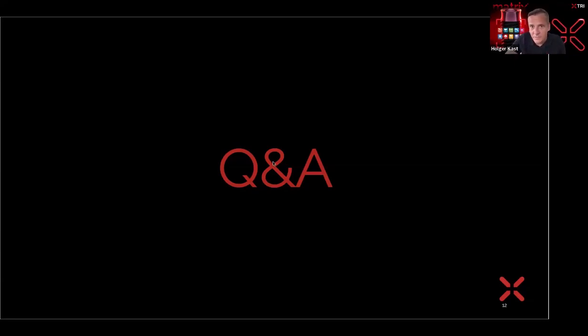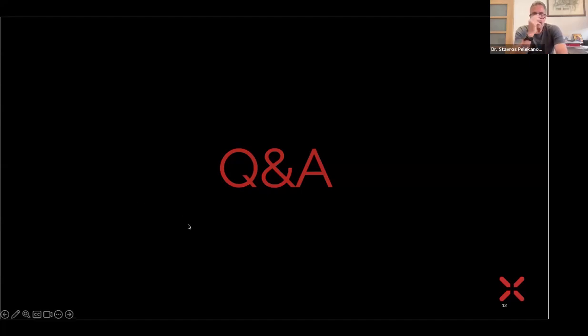I know you're really short on time. That's why the last question: the flex fit of the FP1, is the wax up printed? That's a good question, since I saw it was ready before surgery started. Maybe you can explain how we did that. The flex fit of the FP1 is 3D printed, actually. Unfortunately, the design of the flex fit is not done in the dental software. You have to send it to TRI, and they design the flex fit connection for you. But the material is 3D printed.